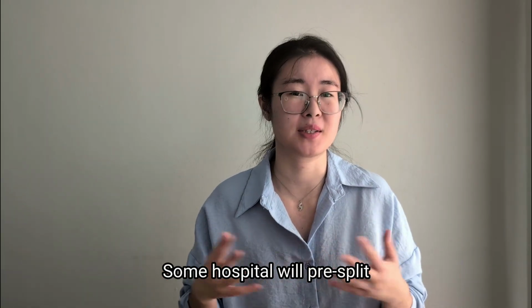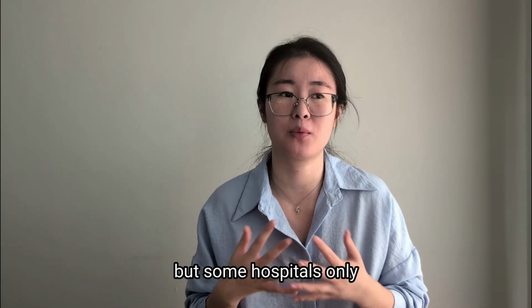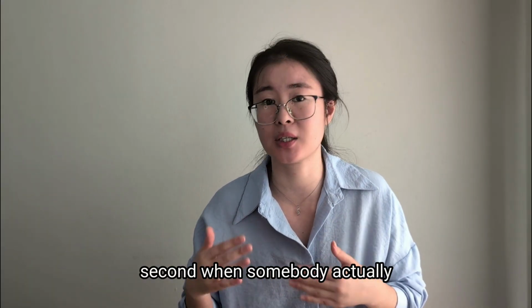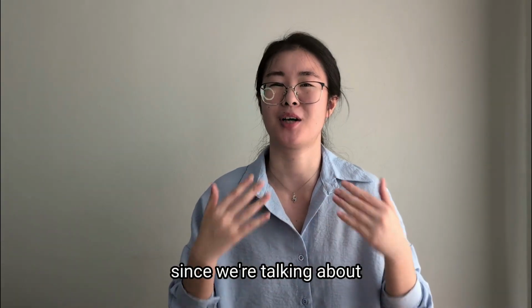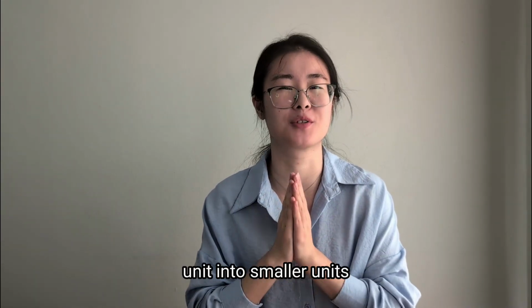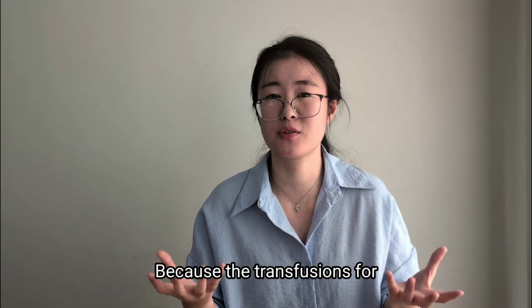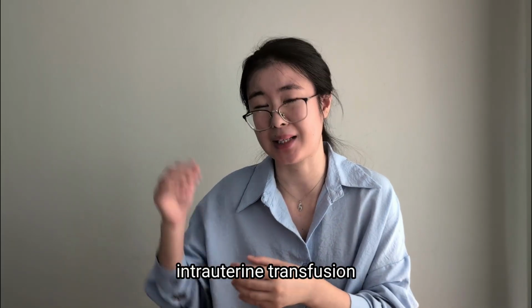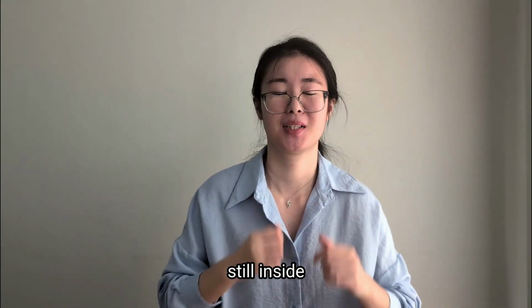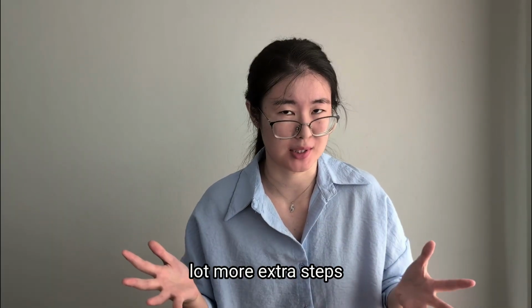Some hospitals will pre-split the unit before they store it on the shelf, but some hospitals wait until the last second, when somebody actually orders the unit, and then they will do the split. And now, since we're talking about cutting the unit into smaller units, let's talk about the babies. Because transfusions for pediatric patients or for intrauterine transfusion, like the babies that are still inside, require a lot more extra steps.